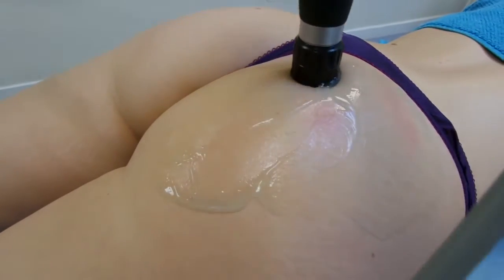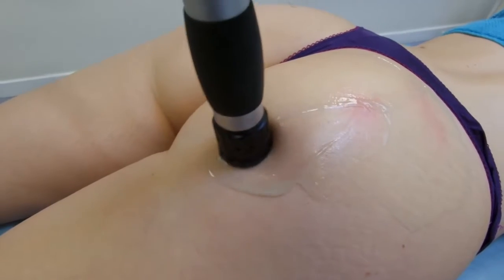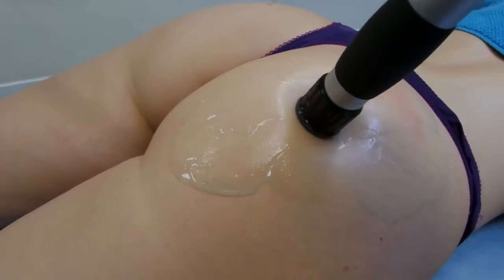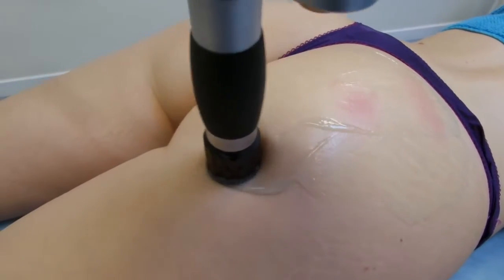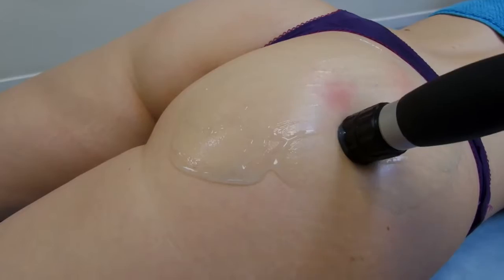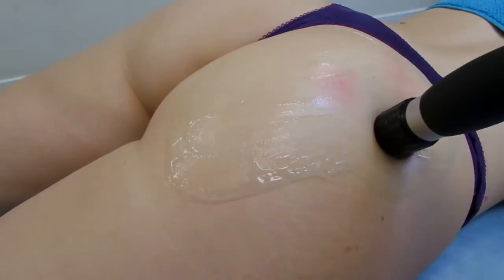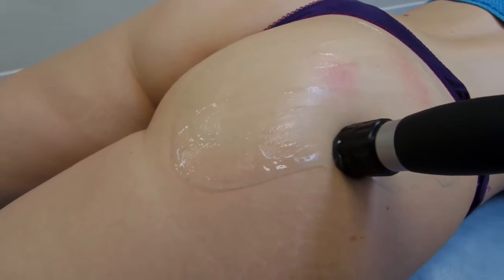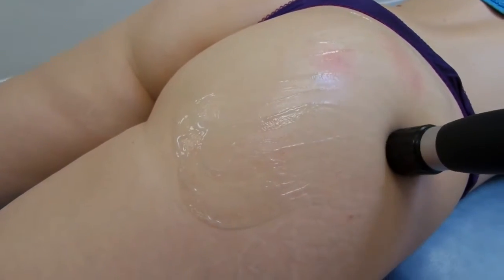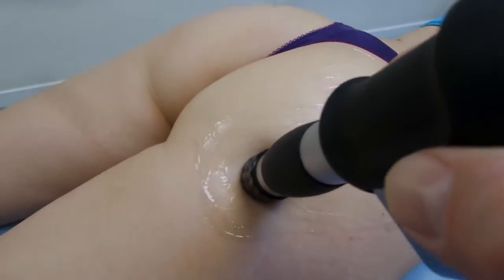Gymna do recommend treating the trigger points for a certain number of shocks each. Usually 200 is deemed to be a minimum, before then going on and relaxing off the entire area, usually with a bigger head and usually at lower pressure, for normally 2000 to 4000 shocks depending on how big the area is, to loosen off the muscles generally.